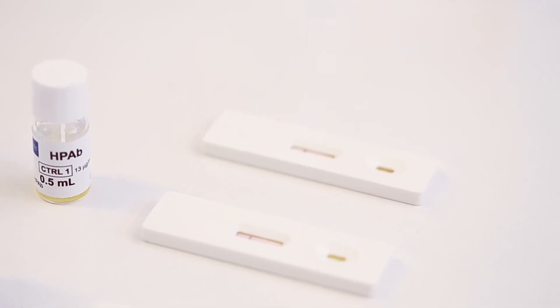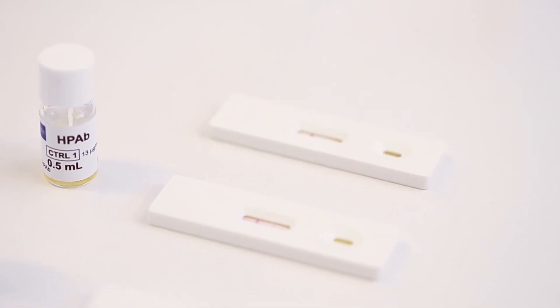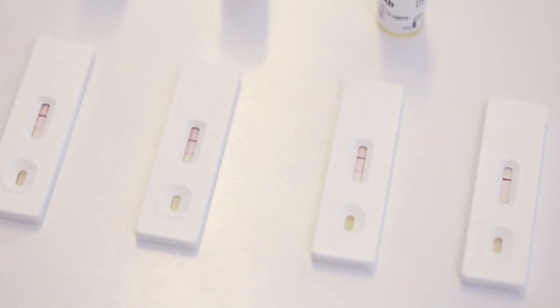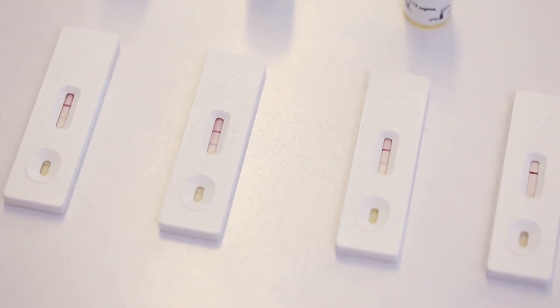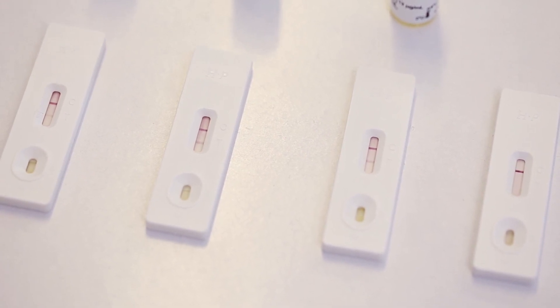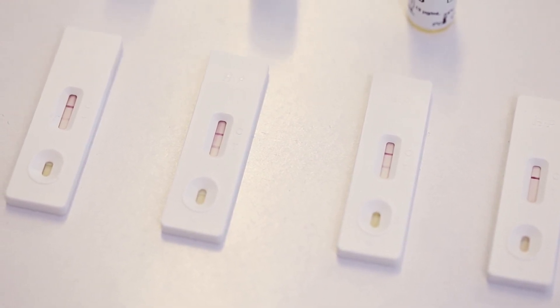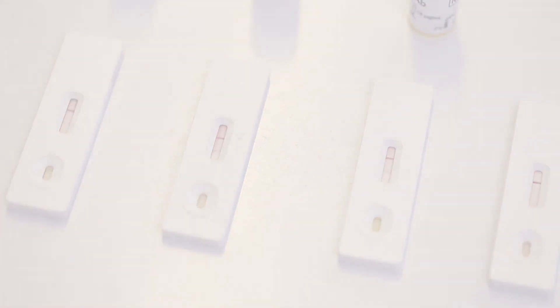For the patient's serum test, the result is negative because we can only visualize the control line. The test line is not visible. The patient does not have H. pylori antibodies in the serum.